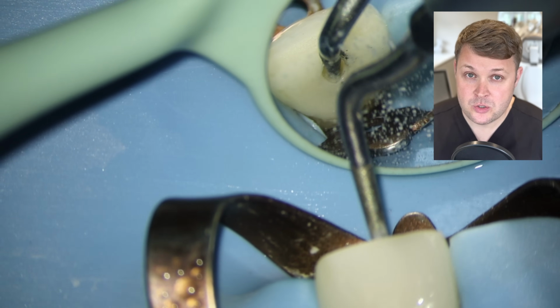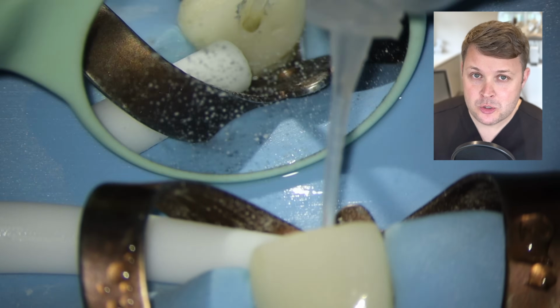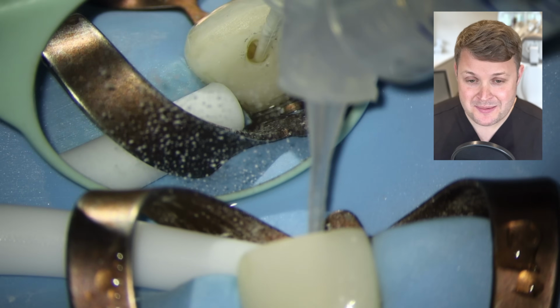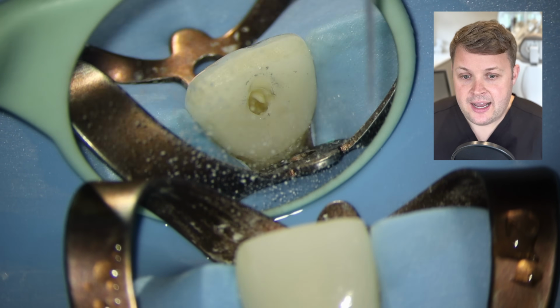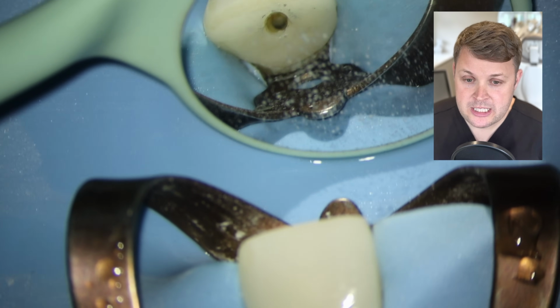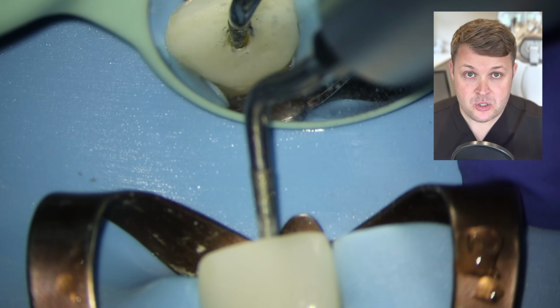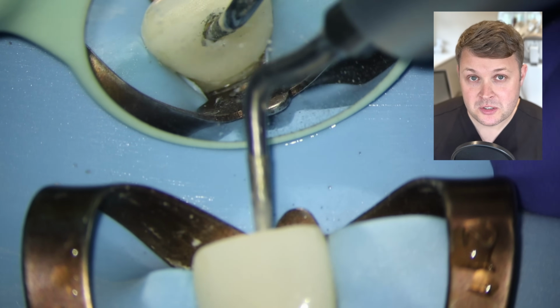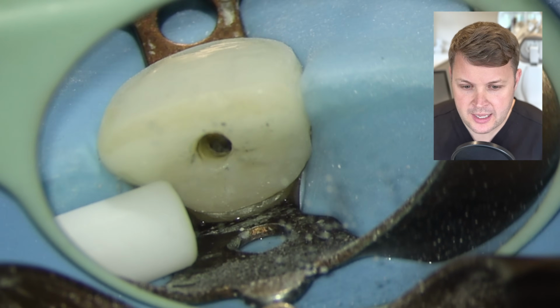In this case I use it without water, but you've got to be careful you don't fracture the instruments here, because putting too much energy down them can make them heat up and break. And then I noticed that the ultrasonic is slightly marking the crown, so I do need to be careful. So being down the long axis of the tooth, sometimes you can sort of cut into the inside ledge, so you've got to be super careful there.